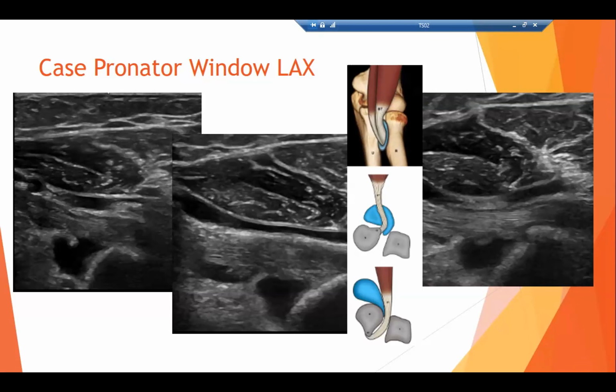A couple of things in that home base. Again, you mentioned the lateral antebrachial cutaneous nerve. That's something I do look at with distal biceps abnormalities, because it can come into play, and there are reported cases of compression with bicipitoradial bursopathy. The recurrent radial artery is not something I normally look at unless I'm going to do an aspiration or an injection. If I'm going to do any type of procedure involving the distal biceps tendon, then I need to identify the recurrent radial artery.